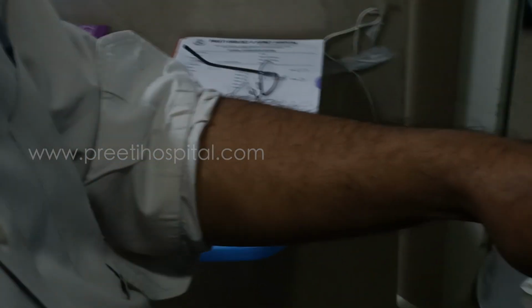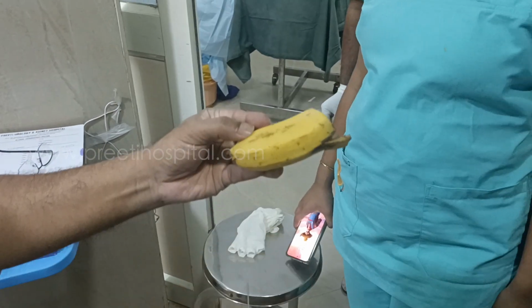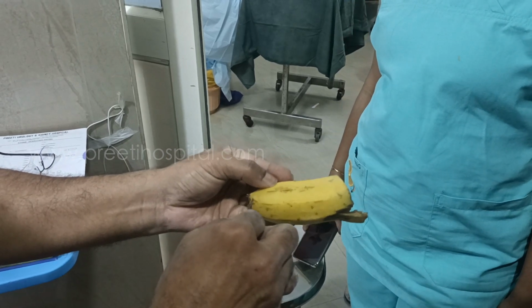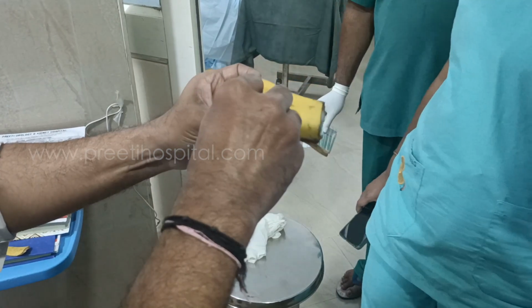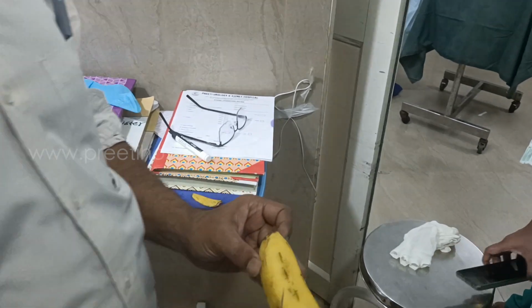This is apex. So if you take like this, it will come more, or if you take like this, it will come more. If you take axial, it will come more. See, entire yellow has come here. Entire yellow has come. Whereas by any means, you cannot, this much yellow only came. You got the point now.